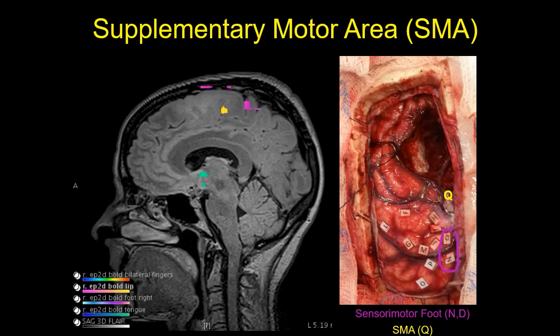Of note, stimulation at site Q during movement of either the arm or leg in isolation had no effect.